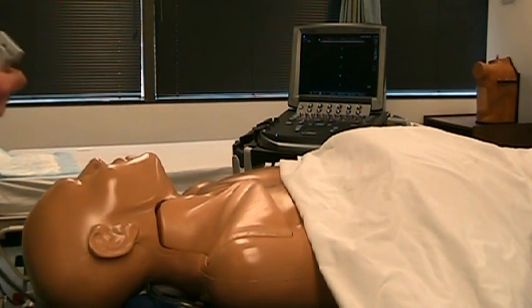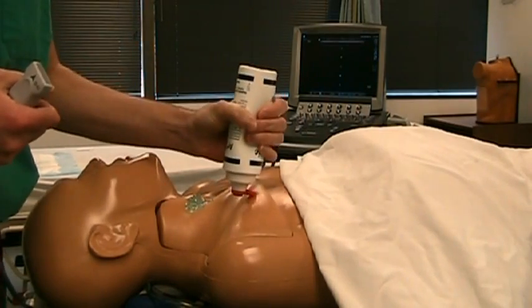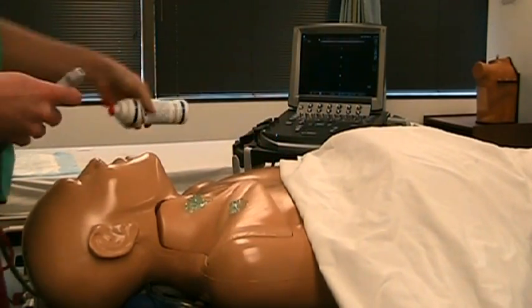Before beginning the procedure, the ultrasound should be used to examine the patient's venous anatomy to ensure that there are no anomalies.